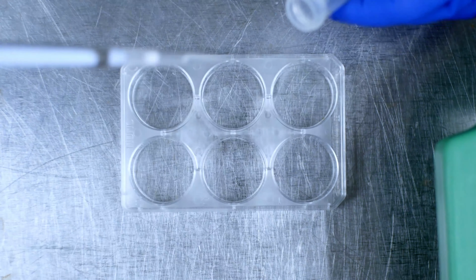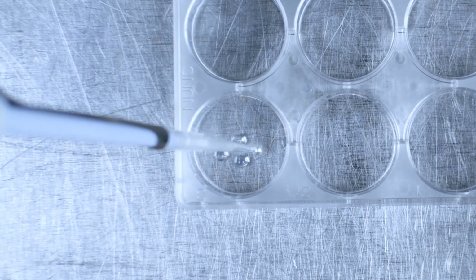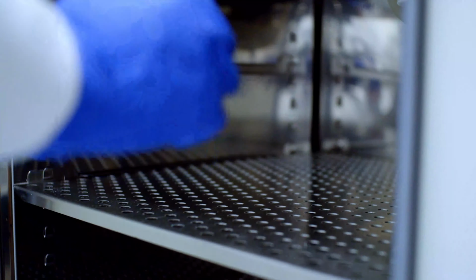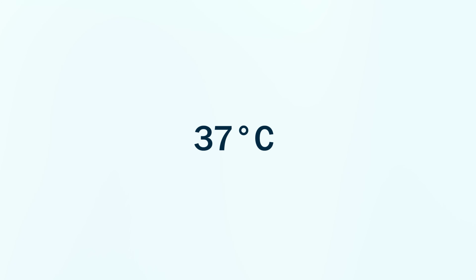Slowly dispense organoid and matrix mixture onto the center of the pre-warmed culture dish. Use reverse pipetting techniques to minimize bubble formation when creating domes. Depending on your organoids, domes can be arranged as a single dome per well or 6 to 8 domes per well. Incubate the plate at 37 degrees Celsius for 30 minutes to solidify the matrix. Inverting the plate while incubating may help retain dome formation and prevent settling of organoids on the plate.